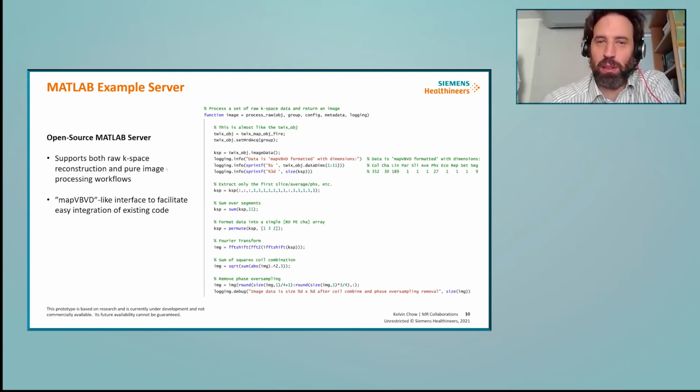So this is not as easy as debugging it offline. Of course, you could connect your external computer to the scanner, and then you could debug offline, but it's not always possible. Not all the hospitals have these capabilities. Imagine if you want to do a multicentric study, you cannot pick the hospitals that have IT people that can connect an external computer at the scanner and maintain it.